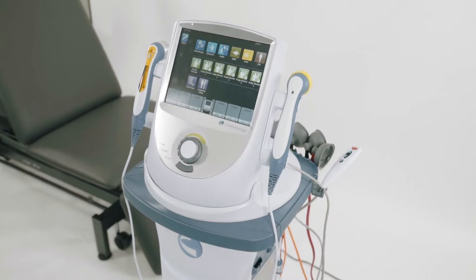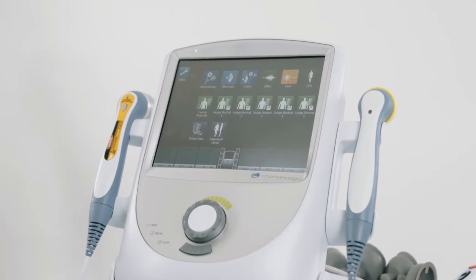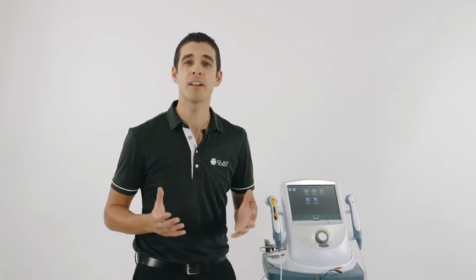The Intellect Neo has a superior EMG signal, a large screen for great visual feedback, and full customisation of the protocols. Here I'll explain how to use it.